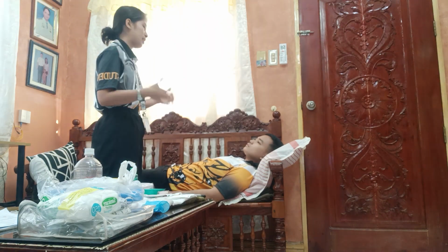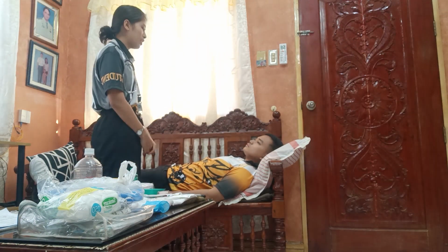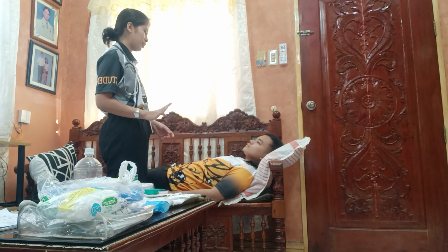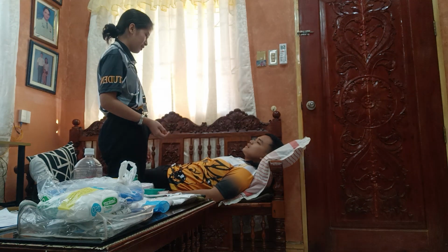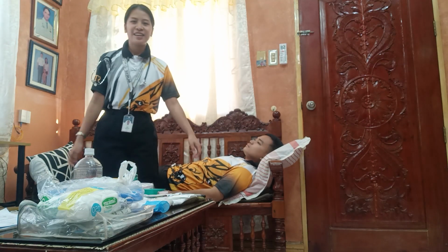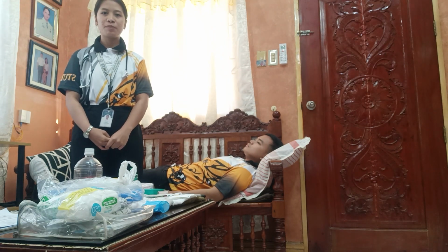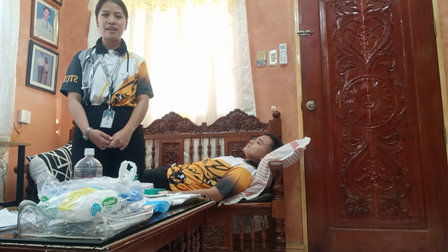Good day, sir. I'm Miaka Vijandre, student nurse from Laye University, Philippines po. Now po I will be doing the NGT insertion na po. Please state your name, sir. And also I will check the ID card. And after that is explain the procedure to the patient and provide rationale as to why the tube is needed.